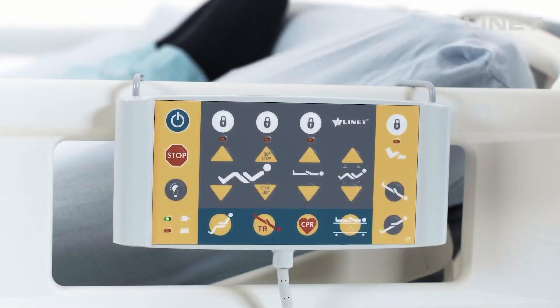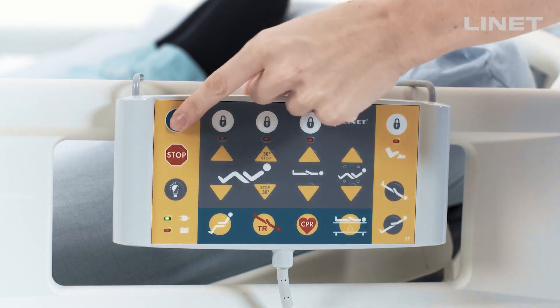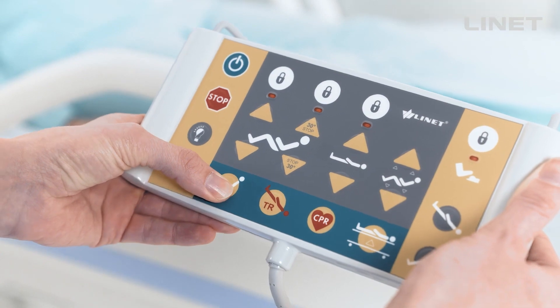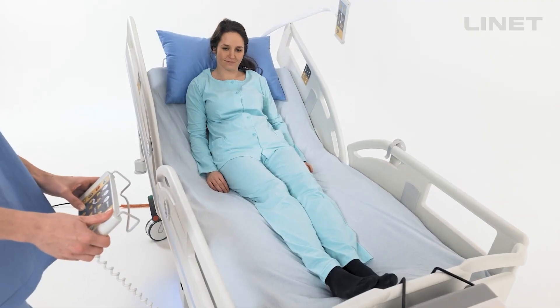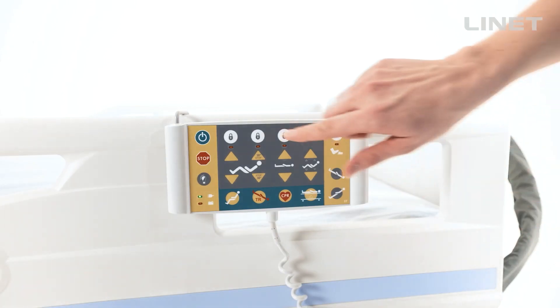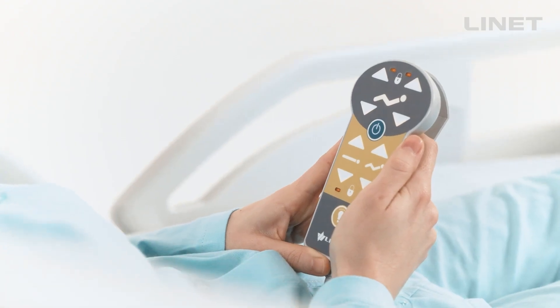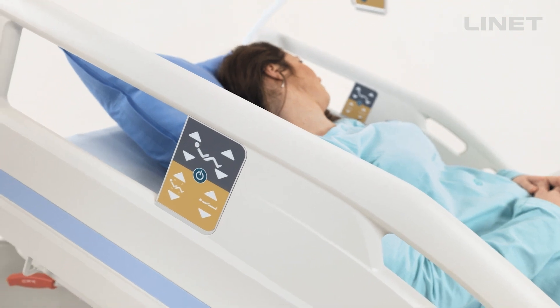To activate the bed controls, push the green go button. This allows for operation of the bed for three minutes. You can find the go button on the accessory control panel, patient handset, and the integrated side rail controls.